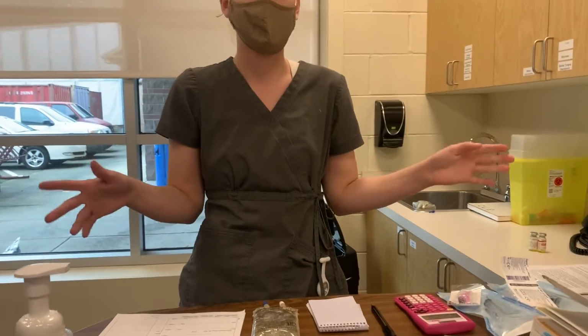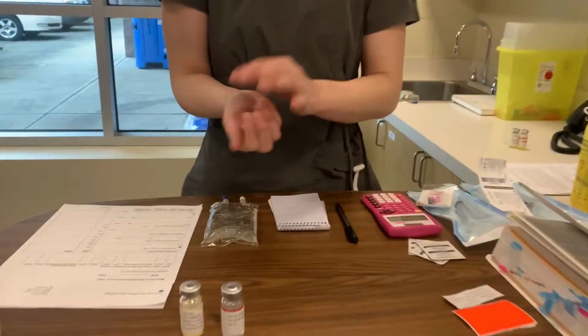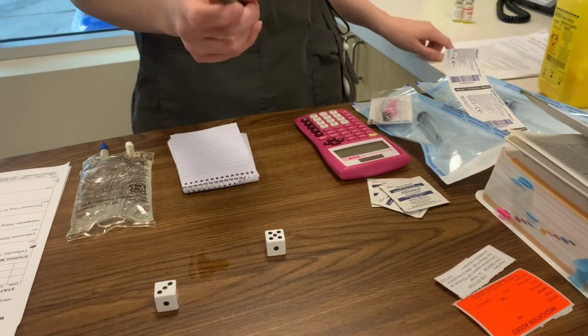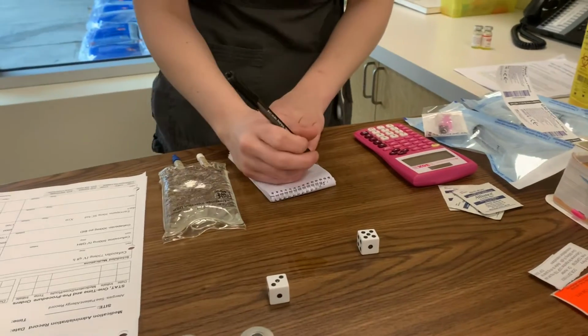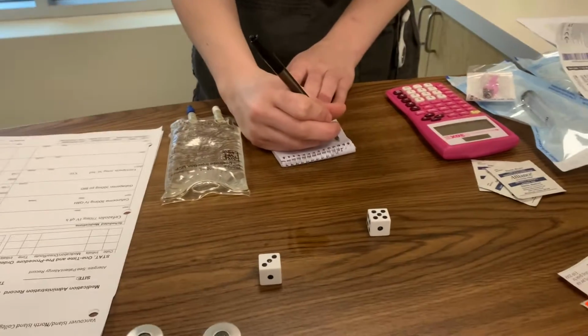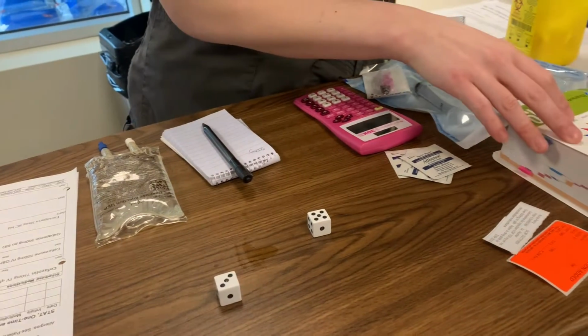I'm Shay. This is going to be my medication administration video for IV antibiotics. I'm going to start out by rolling the dice to see which medication I'll be giving. I'm going to be giving cefuroxime. I know with that one, I'm going to be giving 500 milligrams, so I'm going to write that right away for my dose ordered, 500 milligrams.